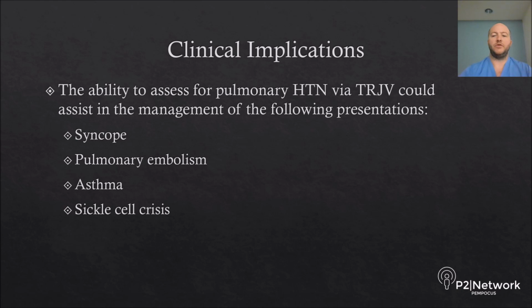The ability to assess for pulmonary hypertension in the emergency department setting could assist in the management of multiple potential presentations, including syncope, pulmonary embolism, asthma, or in a sickle cell crisis, as well as the possible diagnosis of idiopathic pulmonary hypertension.